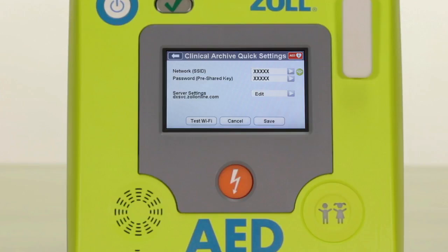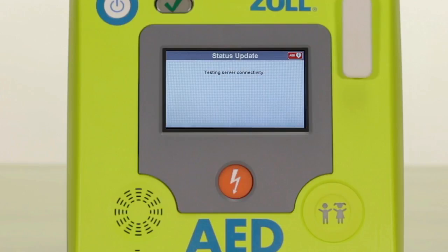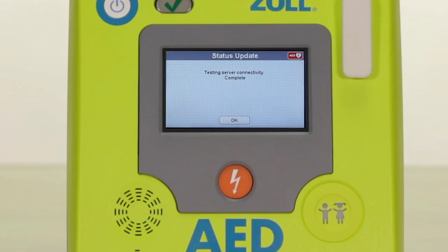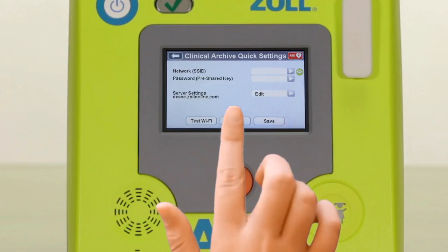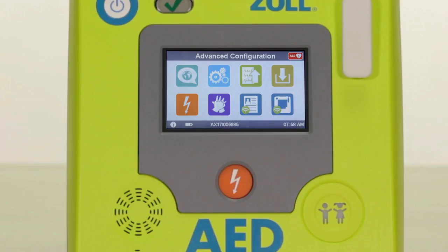Once you've set up your network ID and password, it is recommended that you select the test Wi-Fi option at the bottom left of the display to ensure your Wi-Fi connection is working. If your Wi-Fi test is successful, you will see a screen that states 'testing server connectivity complete.' Select OK and then select save from the following screen, which will bring you back to the advanced settings icon screen.